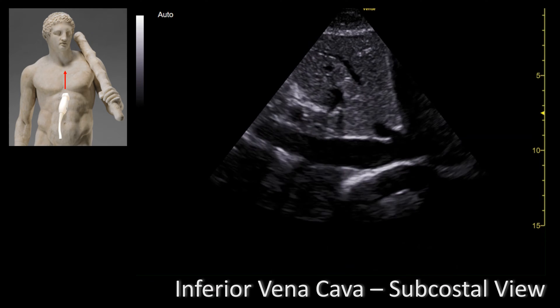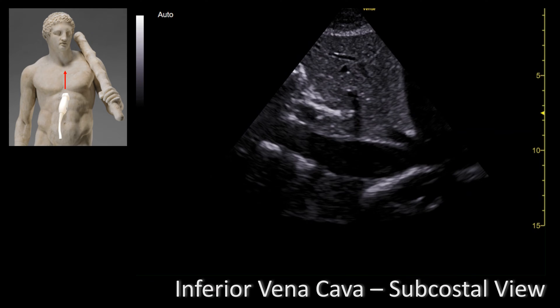This is what the inferior vena cava should look like. You have the hepatic vein, which is located right here and empties into the inferior vena cava, which then empties into the right atrium. It is very important to see the inferior vena cava connecting to the right atrium because it's very easy to confuse the inferior vena cava with the aorta.